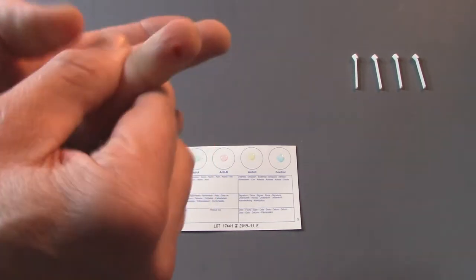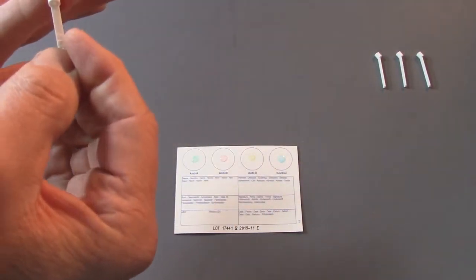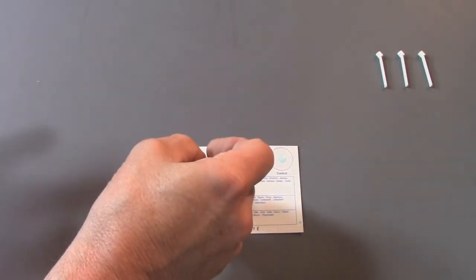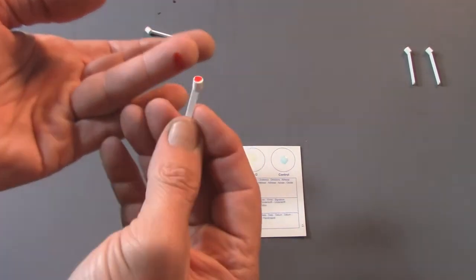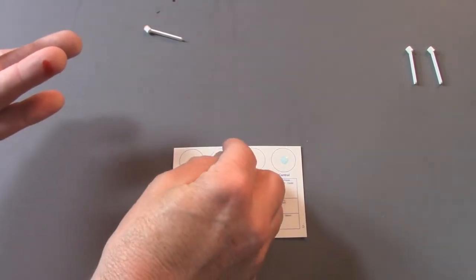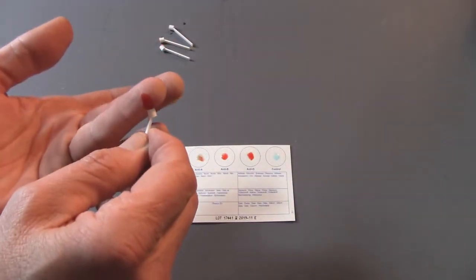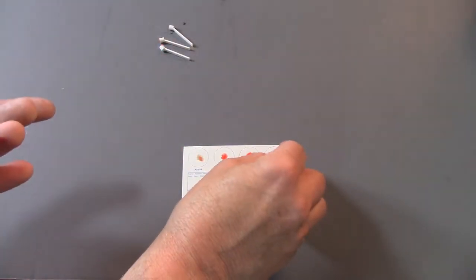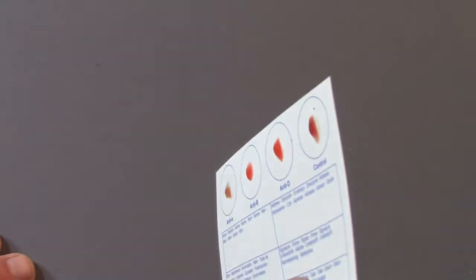Massage your finger towards your fingertip to increase blood flow. Let a large drop of blood fall onto the Eldon stick. Place the stick with the drop of blood in the center of the first reagent circle. Take a new stick and quickly repeat, transferring a drop of blood to each remaining circle using a new stick for each circle. Tilt the card almost upright and hold for 10 seconds at each angle. Be careful not to mix.